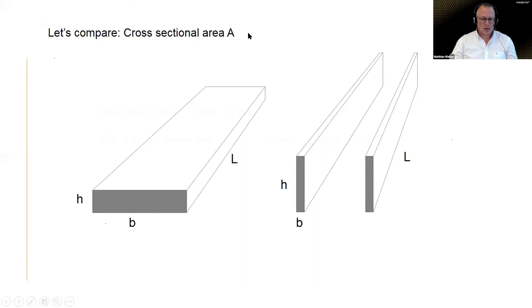Now, if we compare the cross-sectional area, so if we just look at how much metal cross-section we put over the fracture gap, you will find that if you multiply the height times the width of a plate, and in this case, I just measured it and replaced it with a bar, just for simplification reasons. Height is usually 3 millimeters with the majority of plates that you find out in the market, sometimes a little bit more than that. I don't think that it's less than that. And the width is roughly 15 millimeters. So therefore we have 45 square millimeters to cover our fracture.